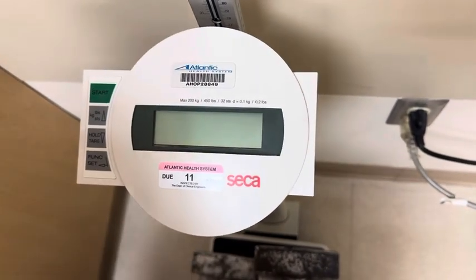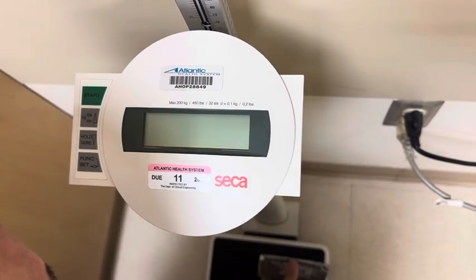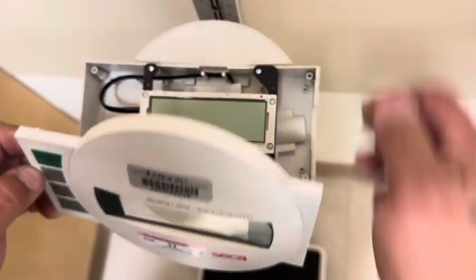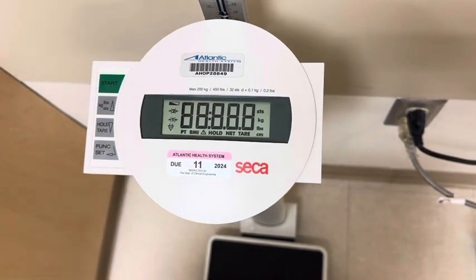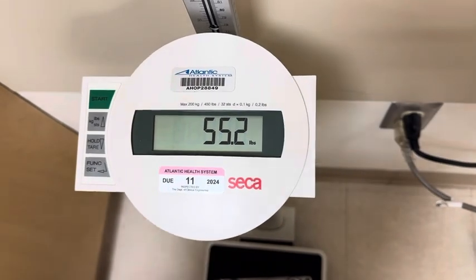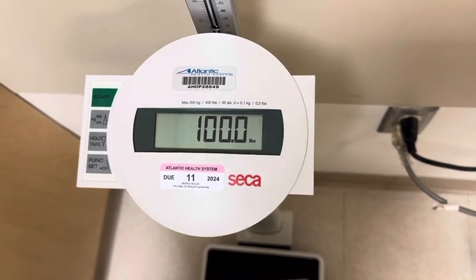Take your weight off, bring that switch back, turn it on, and that is how you adjust the calibration on a Sika 769.